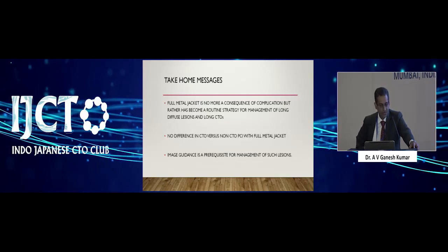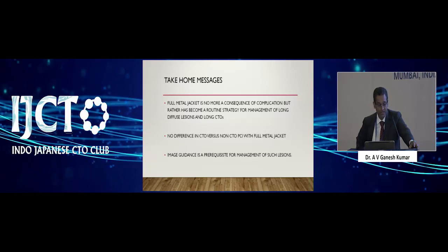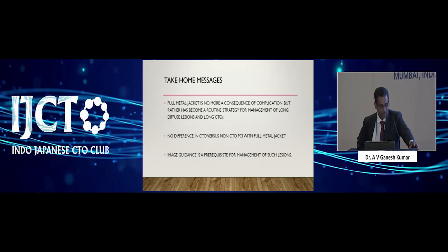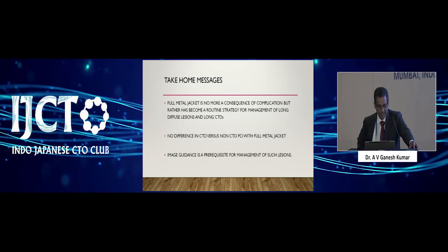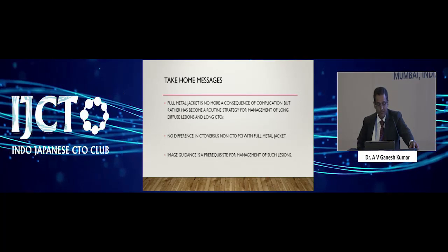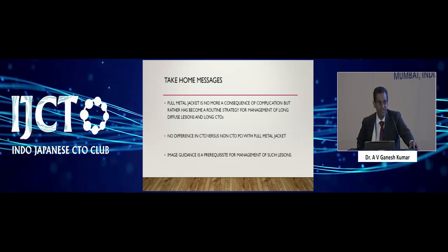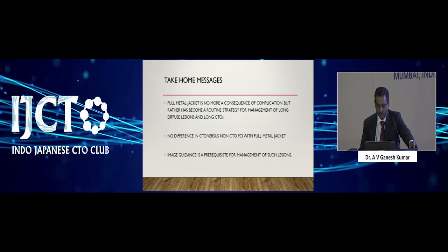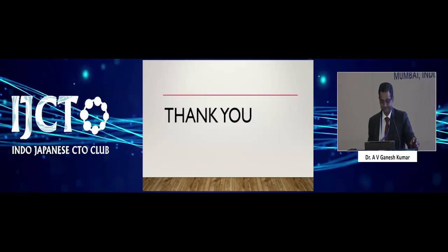Full metal jackets are no more a consequence of complication, but rather have become a routine strategy for most operators nowadays. There is no difference between CTO and non-CTO full metal jackets. And the most important thing is, when you are using imaging and doing right sizing of the stents, perhaps that will be the way forward. Thank you very much.